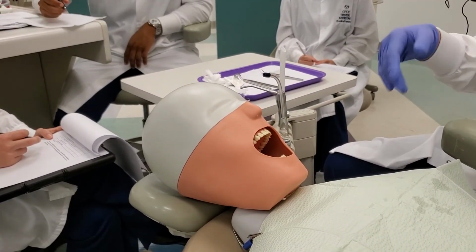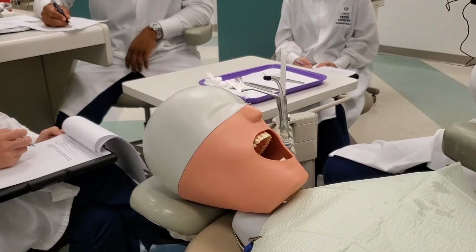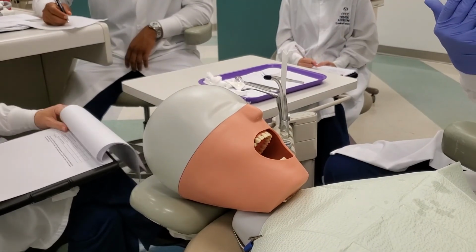Avoid resting the bevel on the tissue, keeping the bevel parallel to the tooth, keeping the throat clear of water, and then of course following the aseptic technique.